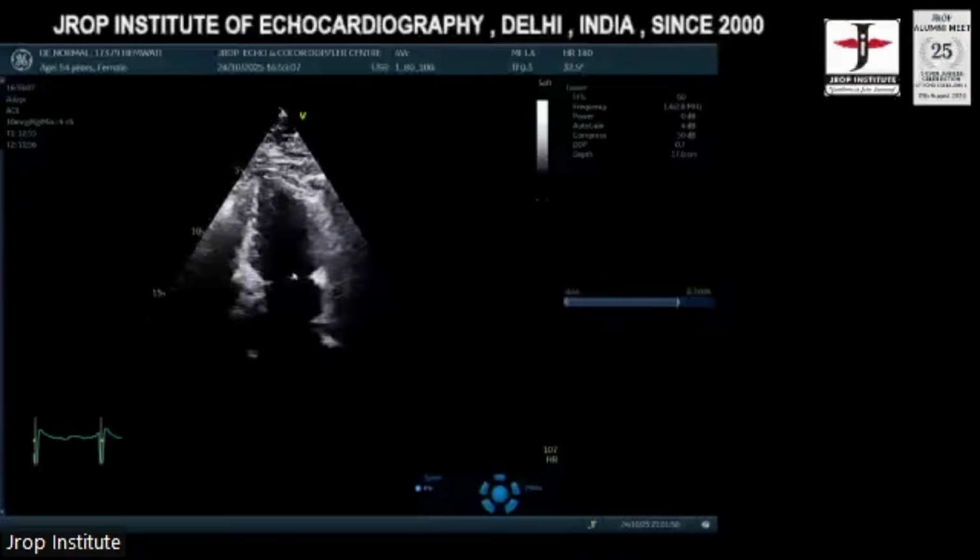Here I'll keep the cursor. Okay, sir. Understood. Dr. Anirbar Singh.